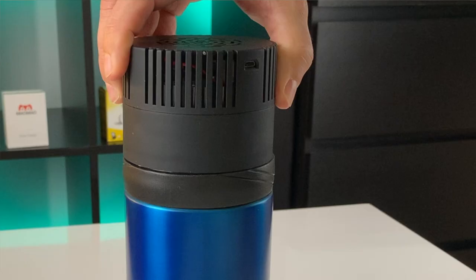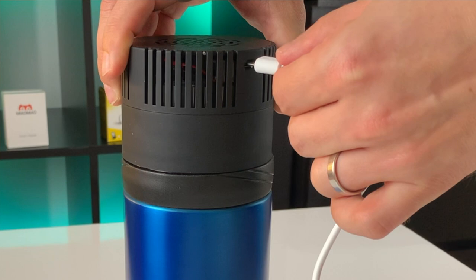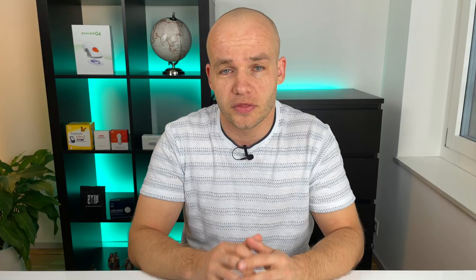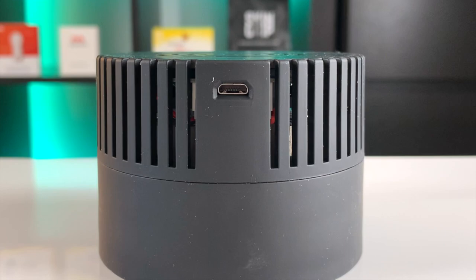The second option is using this black lid that has a cooling function and you can connect it with a micro USB cable. For that you need a socket or at least a USB outlet, but these are usually available in most cars, on boats, and on airplanes. The USB solution cools the inside of the bottle by 25 degrees Fahrenheit. So if the temperature outside is 90, the temperature inside the cooler will be 65. And you can combine these two options to get the most out of the cooler, so you can put the ice pack in and power the cooler using the USB cable.